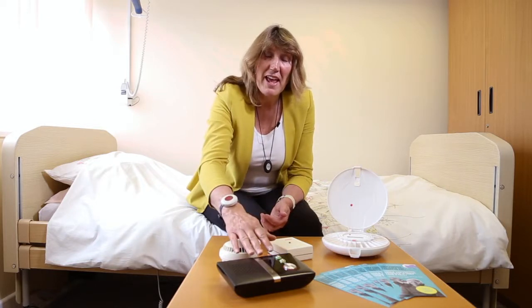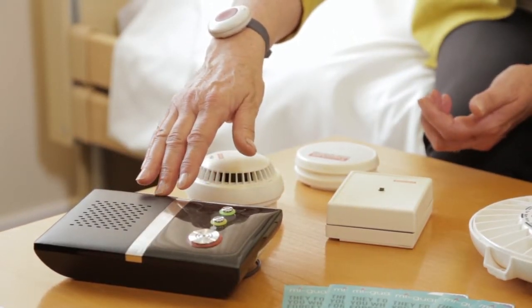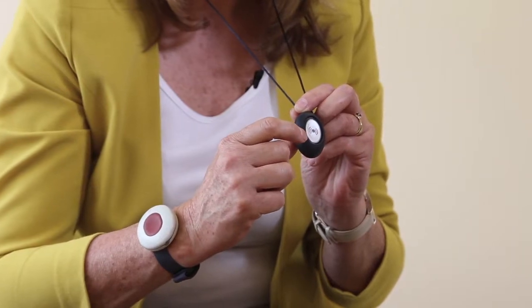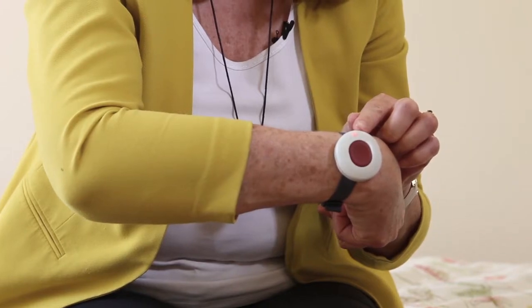The pieces of equipment at the back of the table here are examples of Telecare equipment that work in connection with a care line or a community alarm system. This simple box is connected via your telephone line to a call centre which operates 24 hours, 7 days a week. The call centre can be called when you need help, either by pressing the pendant, which is worn around the neck, or by pressing a pendant which is worn around the wrist, whichever you prefer.